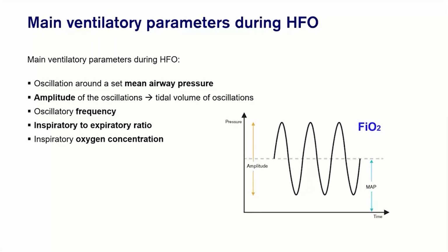However, there are also publications, for example, from Jane Pillow about I/E ratio and the impact to the mean airway pressure in the lung. So not what we see from outside, what is displayed on the ventilator screen, but what is really happening in the lung.